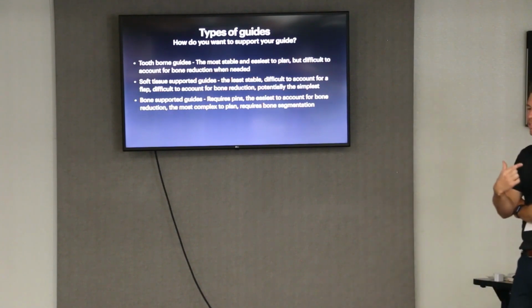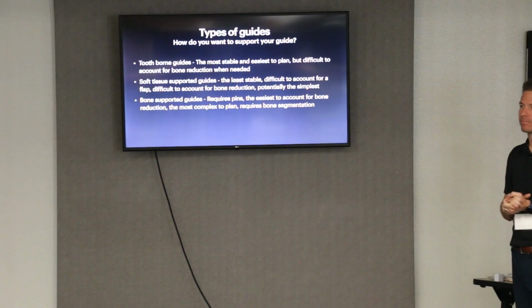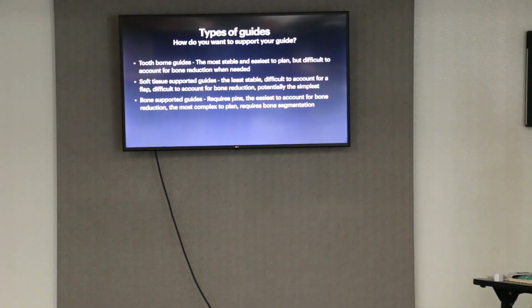Because when it locks on, these guides are pretty tight. It just holds everything together. And if you have 3 other teeth that are solid, it'll be fine. Depressible teeth would probably be the no-no. If you see a big periodontal lesion on that X-ray, it's going to stand out like an elephant. You see it too when they're moving around with their tongue. It's a no-go. But yeah, that's a good question.